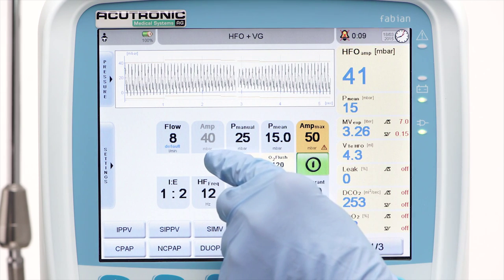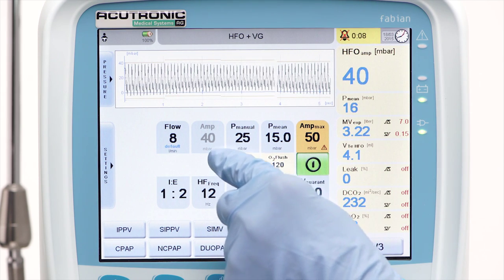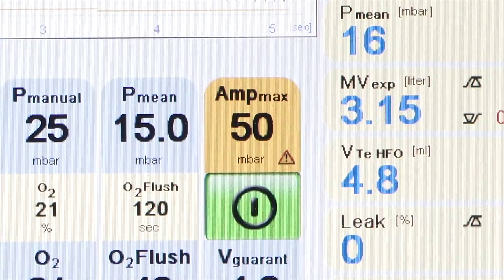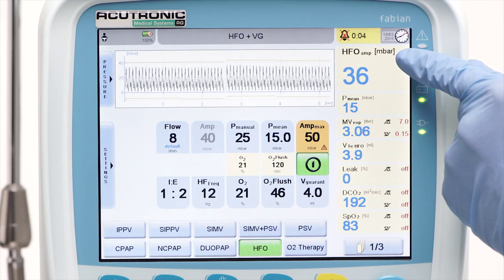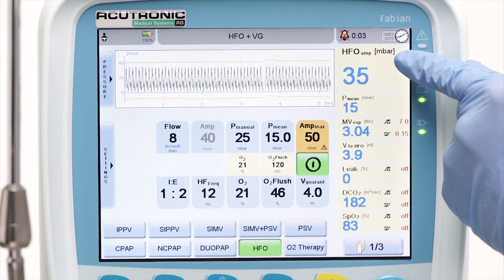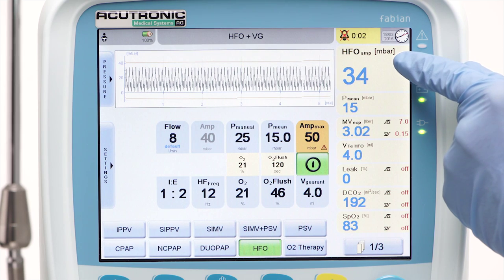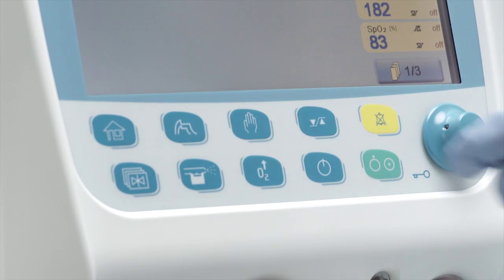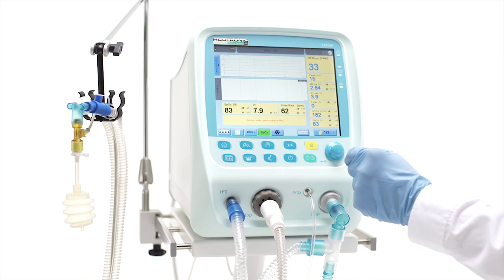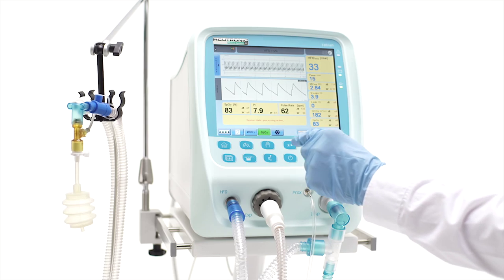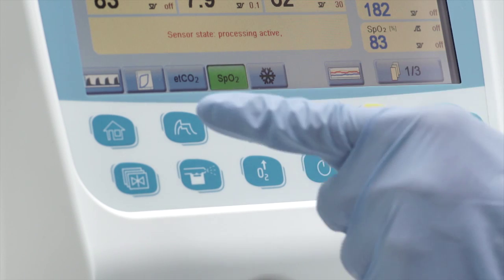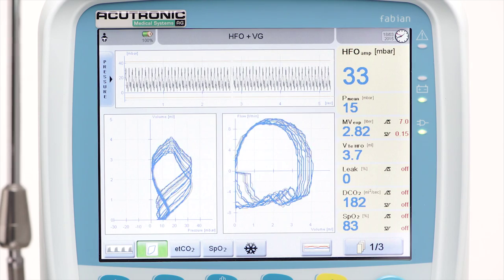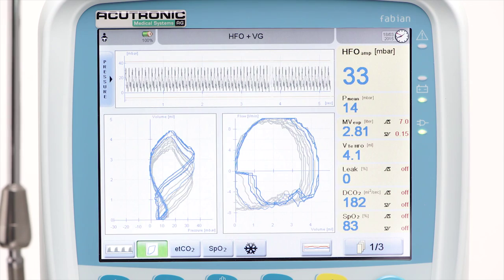The amplitude is now automatically regulated by the volume guarantee target value. The maximum amplitude allowed range can be set in the orange colored amplitude max button. By accessing the wave screen in HFO, the Fabian can show different real-time diagrams, including the loops which can easily show the patient's spontaneous breathing and his strength during HFO.